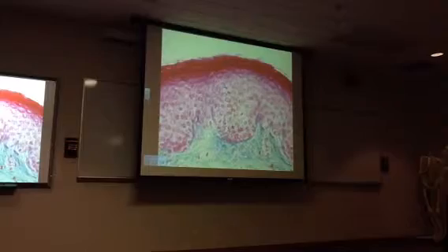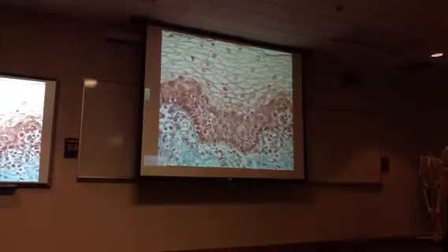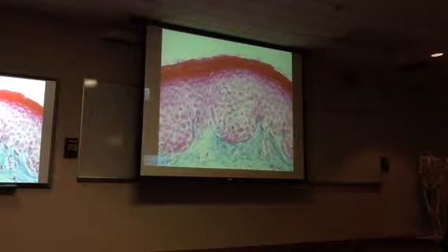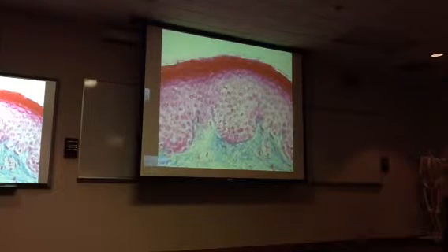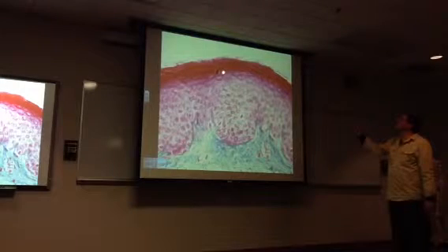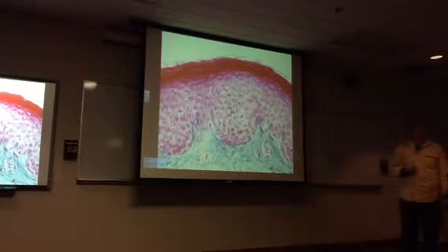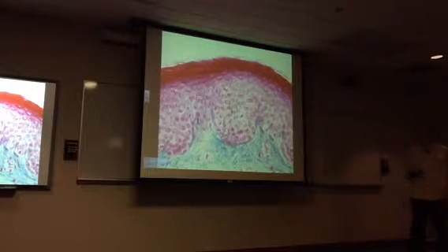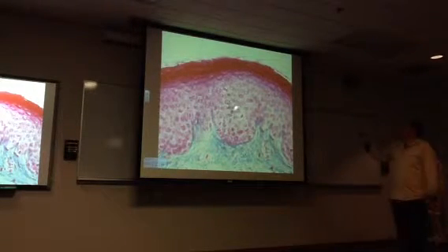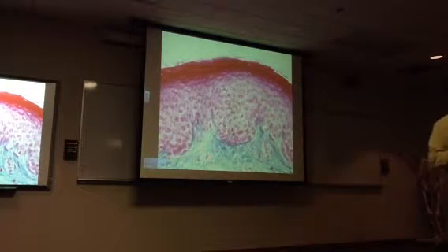That's non-keratinized, right? Yeah, that one and that one are non-keratinized. That one is keratinized. Okay, this is the keratin layer, like so, and it's a little bit overstained. But if you see some of the nuclei right near the surface, they're very flat. So it's a stratified squamous with keratin, even though these nuclei look like they're more oval or cuboidal.